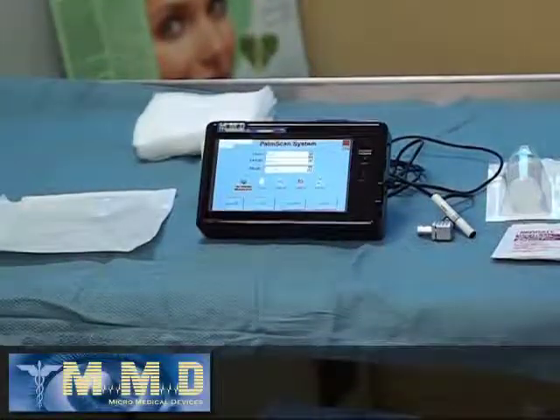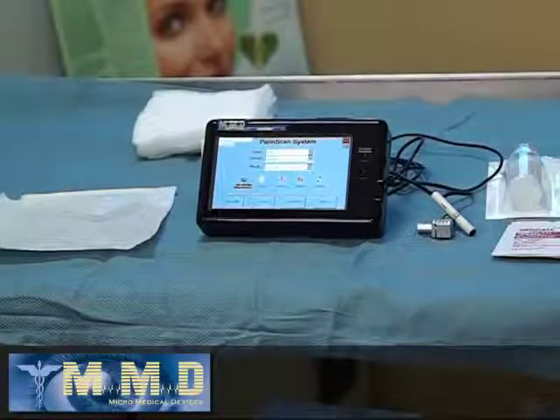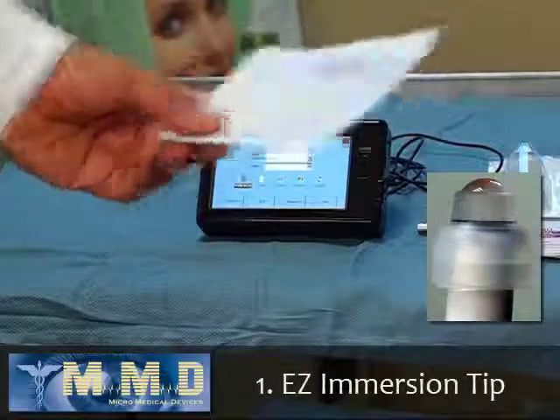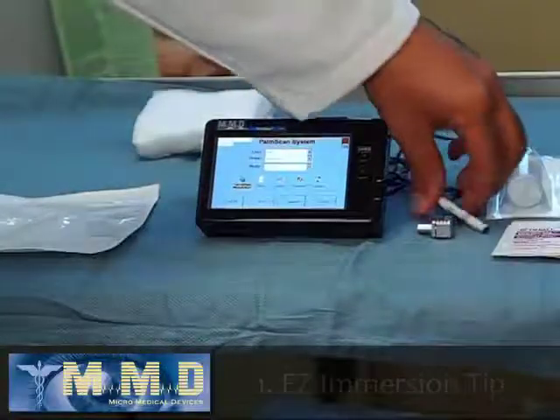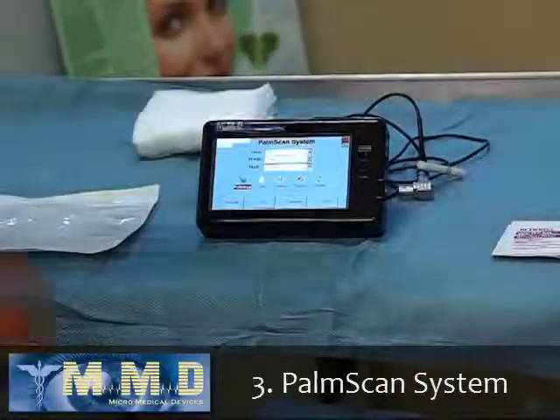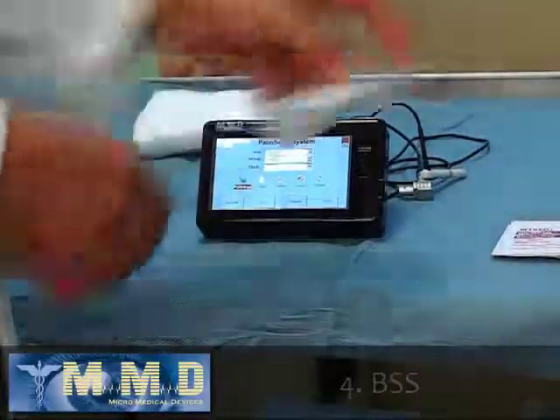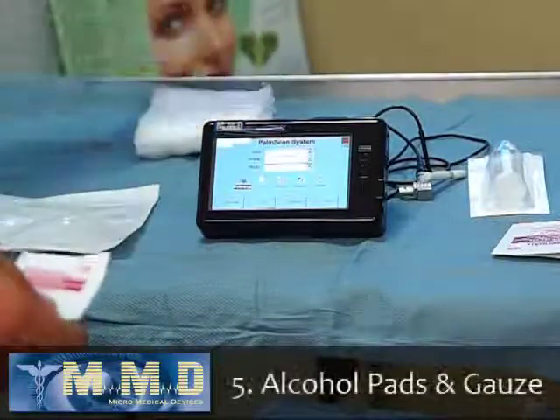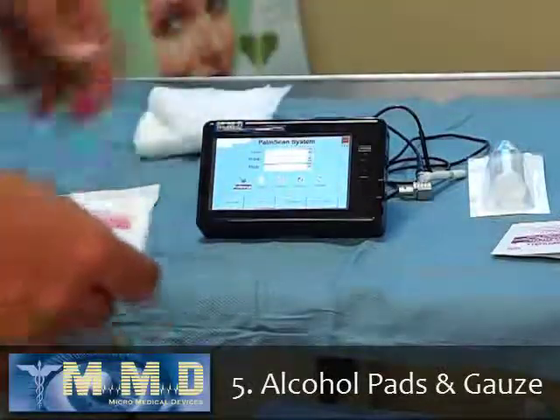The supplies that are needed to do the EZ immersion is obviously the EZ Immersion Tip, the transducer, and the PalmScan system. I like to use a BSS and some alcohol pads and a few sterile gauze.